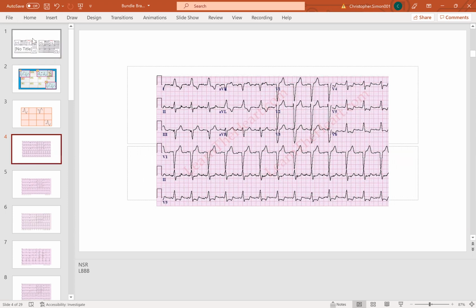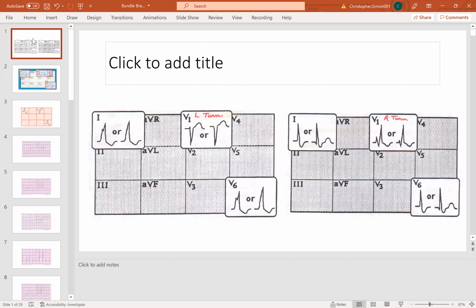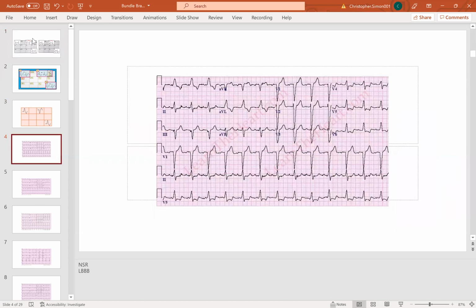It's really easy. You just got to memorize a couple of things, okay? So for me, if I'm looking at a left bundle branch block, I need to identify first that I have wide QRSs. I'm not expecting you guys to know this yet, of course. We're working on it, but I just want to point out that see this guy in V1, this is a wide complex QRS.